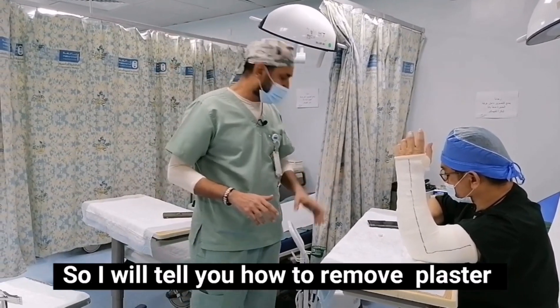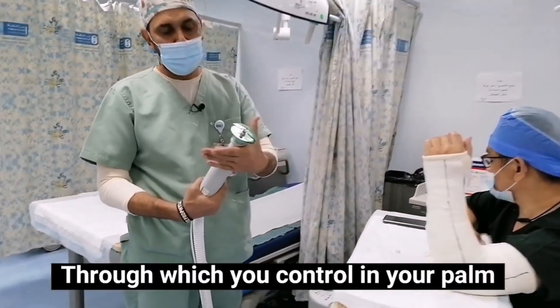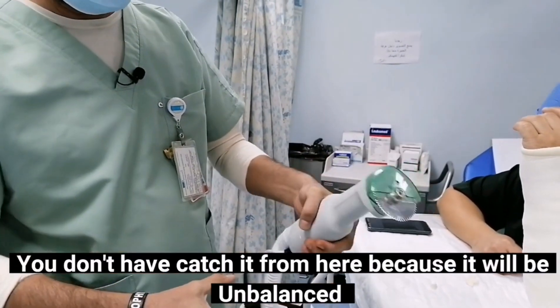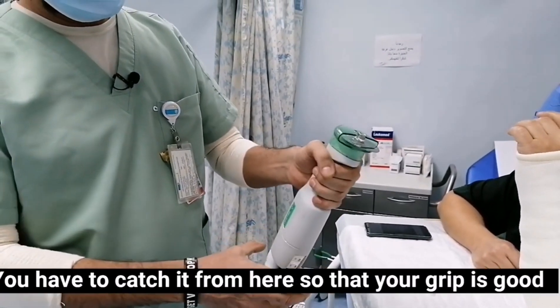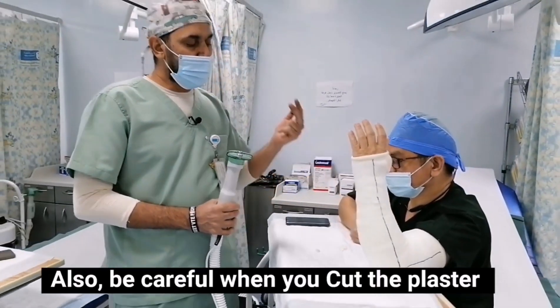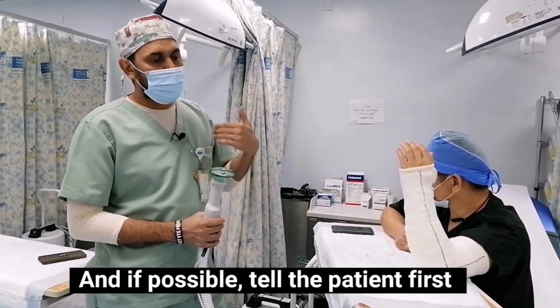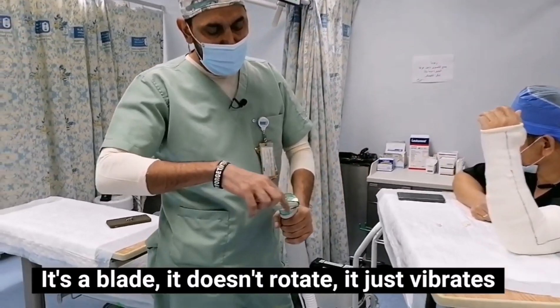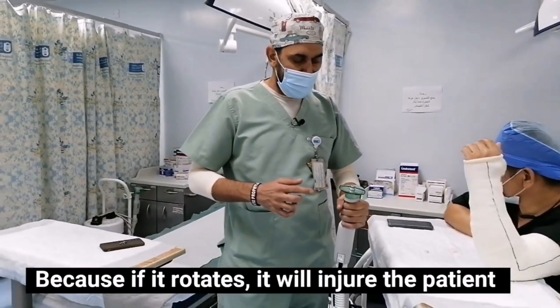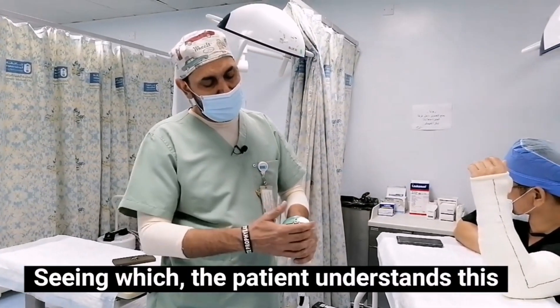I will teach you how to do it. There is a holding point on the plaster cutting saw through which you can control your palm. You don't have to hold it from here because you will not be able to cut it properly. You have to hold it from here so that your grip is good. Also, be careful when you are cutting the plaster and do not keep the blade there for too long. Tell the patient that the blade doesn't rotate — instead it vibrates. Because if it rotates, it will injure the patient. It just vibrates, but it looks like it's rotating, which frightens the patient.